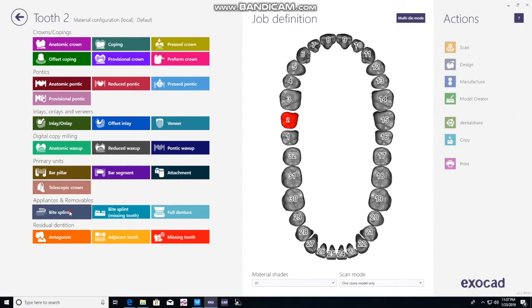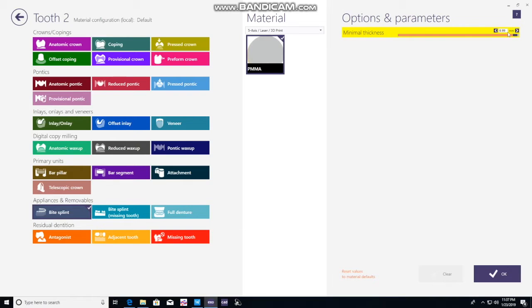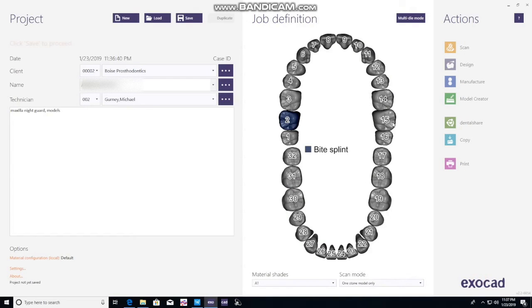You click on a tooth, click on Bite Splint. You can change the minimal thickness that it's recognizing, but you don't have to play with that too much. Click OK, then hold Shift and click on another tooth and you'll highlight all of them.